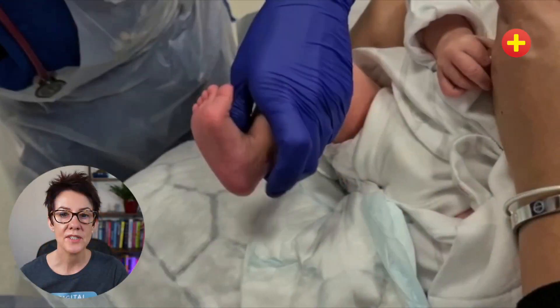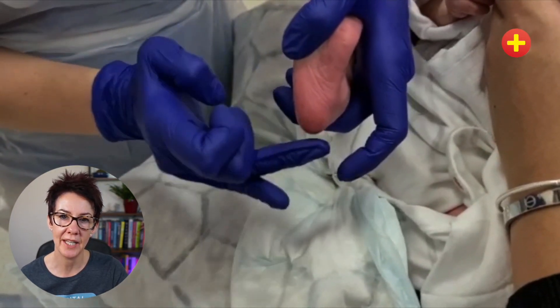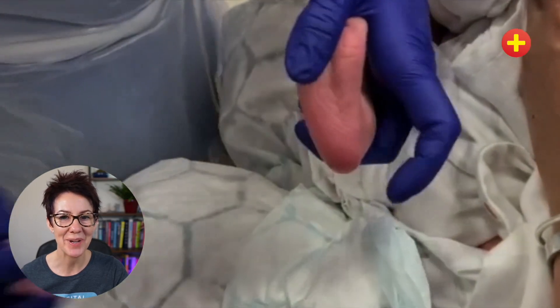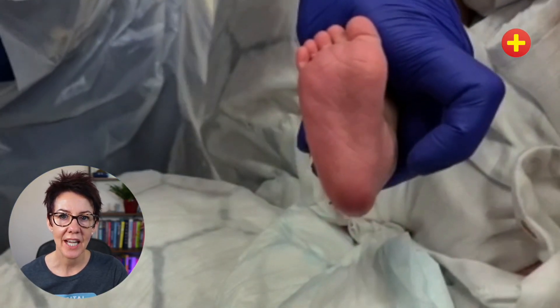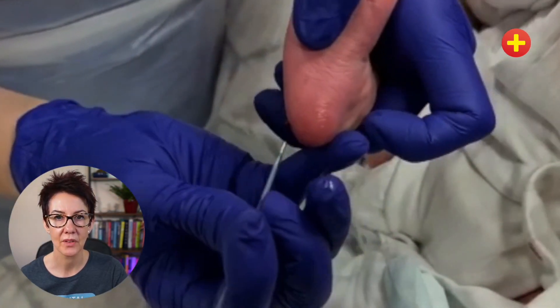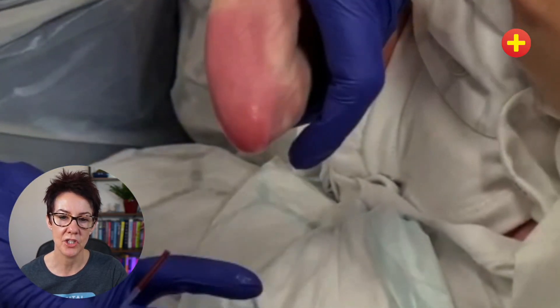So use the sides and avoid the actual pole of the heel. When you start the procedure, hold the baby's calf and foot firmly in your non-dominant hand. If you're going to use white soft paraffin, now's the time — remember to use it sparingly. Prick the side of the heel and then get your capillary tube ready while you wait for the first drop of blood to form. Touch the capillary tube to the drop of blood, not to the foot itself, and allow the capillary action to suck it up into the tube.